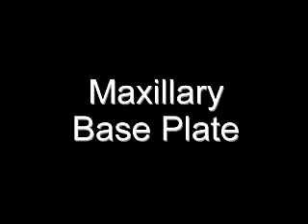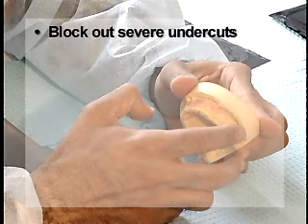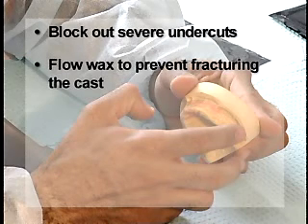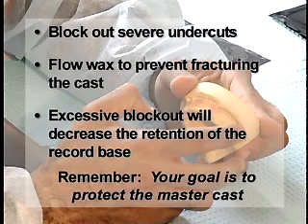Block out severe undercuts on the maxillary cast with hard base plate wax. If the ridge is very thin, flow wax on each side to prevent fracturing the cast. Excessive block out will decrease the retention of the record base. Remember, your goal is to protect the master cast.